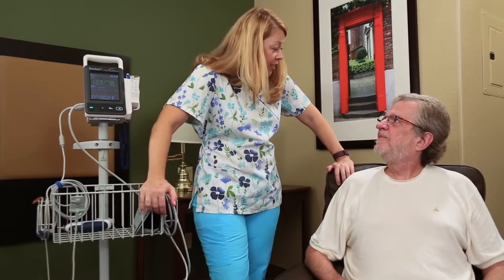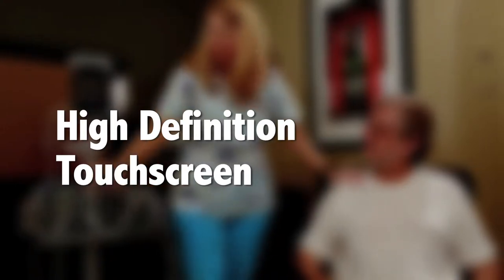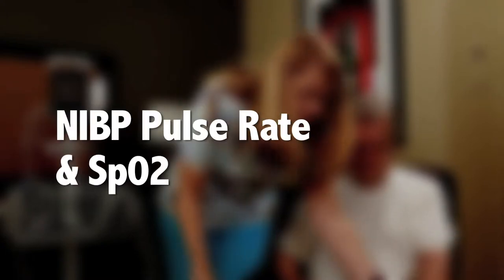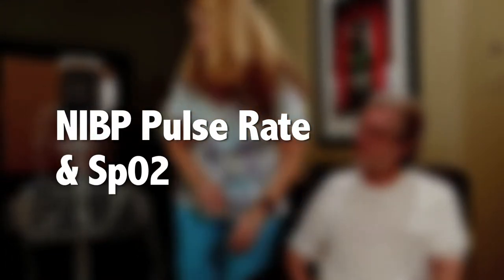The Rosebud VC offers a high definition touch screen that provides a clear view of the patient's data, easy to use touch pad controls, and an RS-232 interface that allows direct export of data into an EMR. Standard parameters include NIBP, pulse rate, and SpO2.